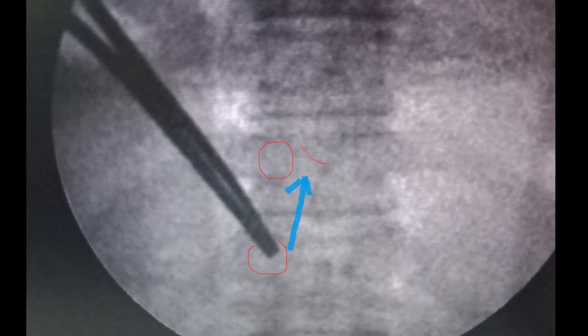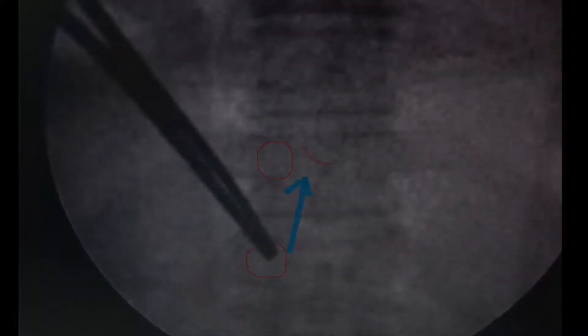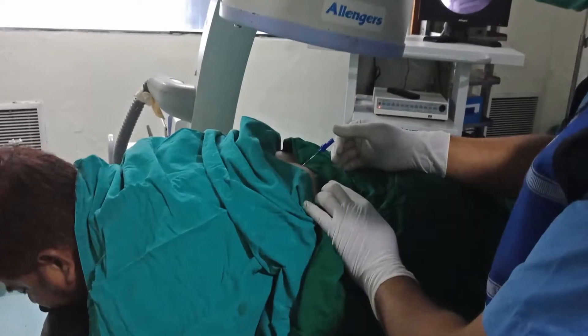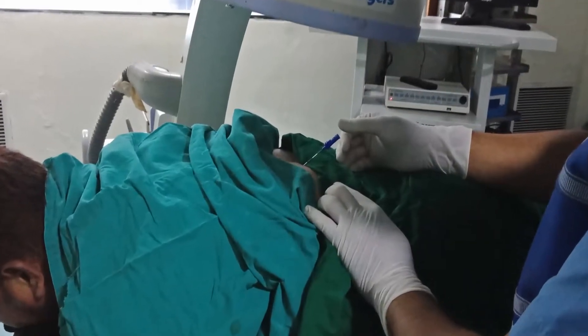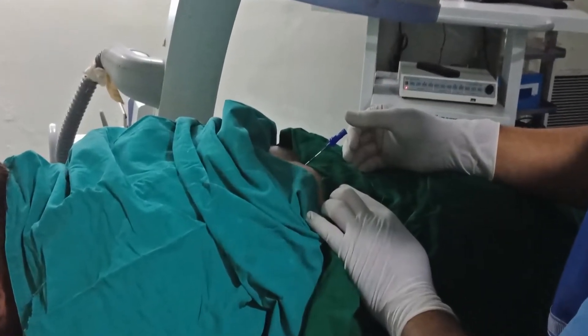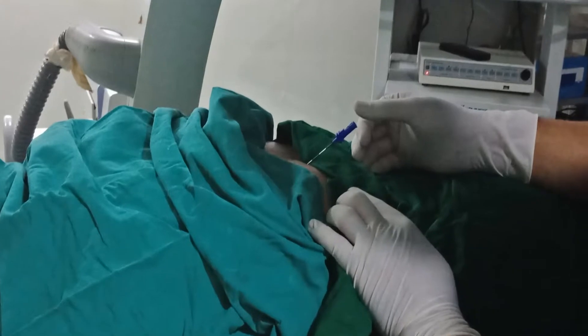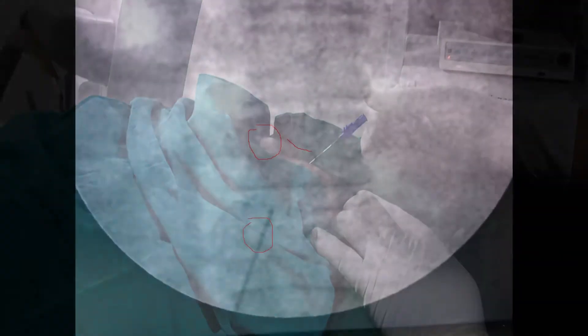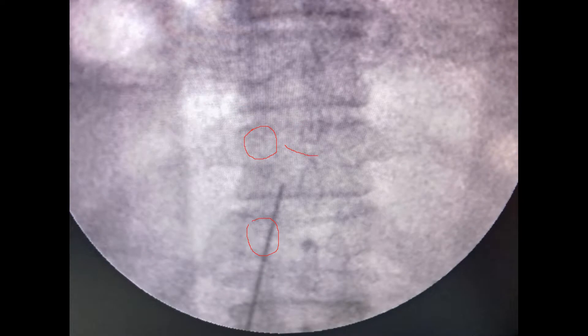Give local anesthesia in this direction. A 40 to 50 degree angulated epidural needle is inserted. The needle is advancing toward the upper border of the lamina.